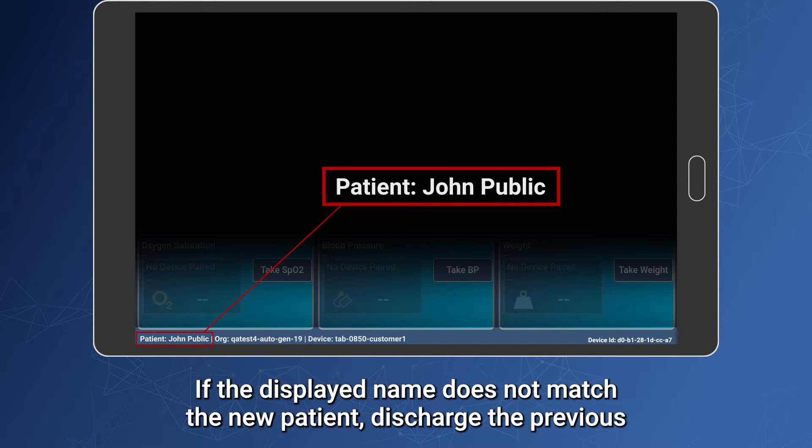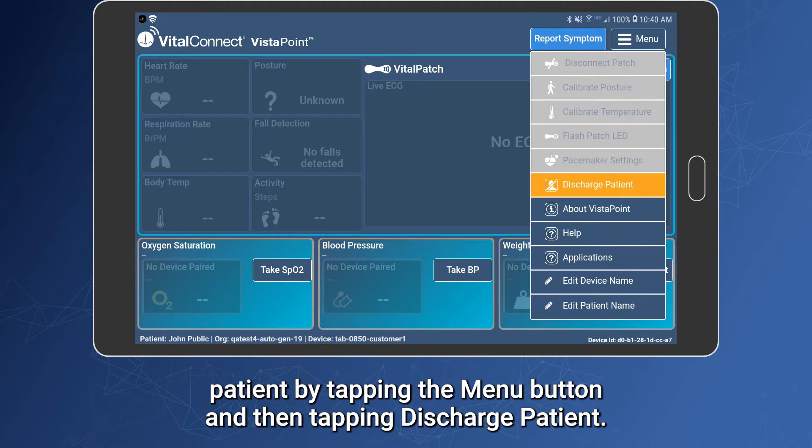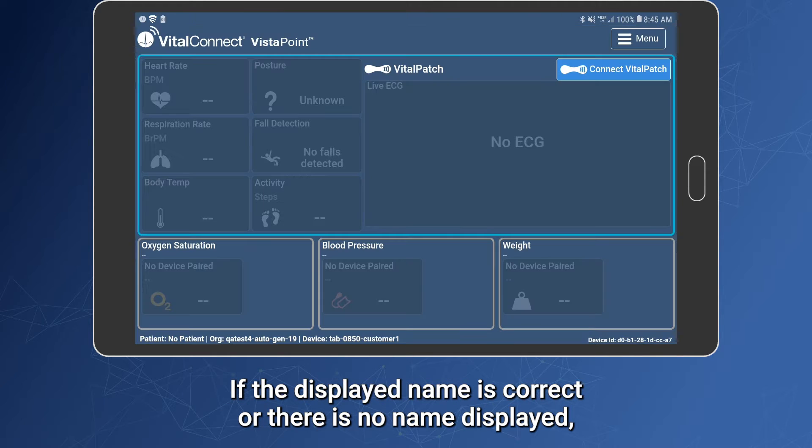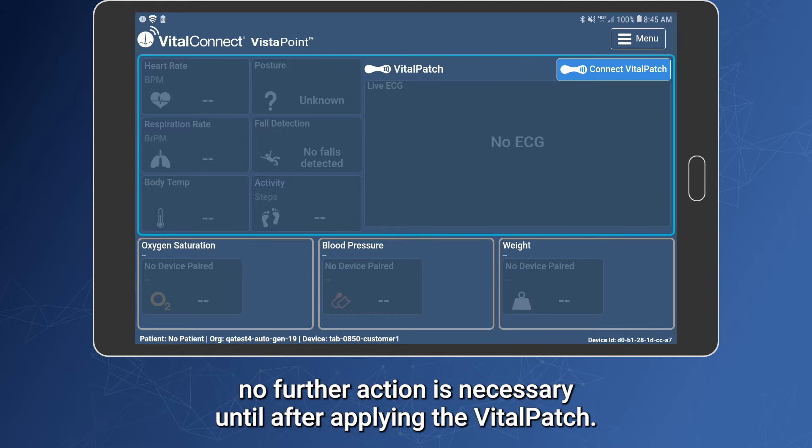If the displayed name does not match the new patient, discharge the previous patient by tapping the menu button and then tapping Discharge Patient. If the displayed name is correct or there is no name displayed, no further action is necessary until after applying the Vitalpatch.